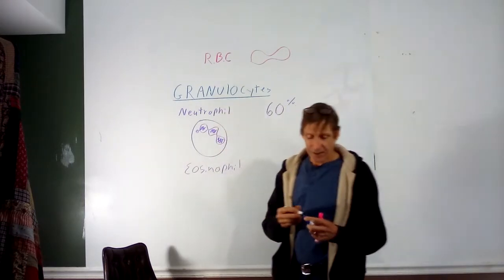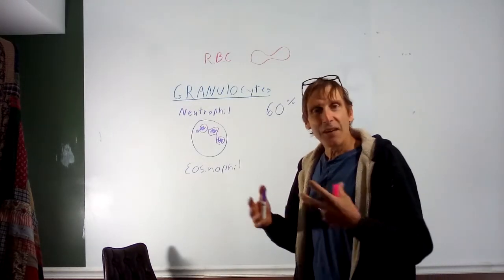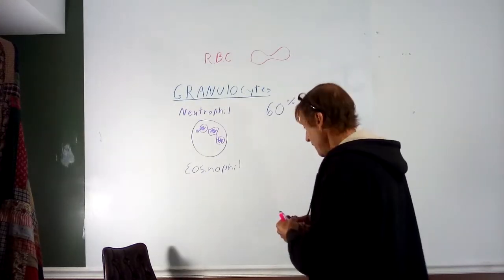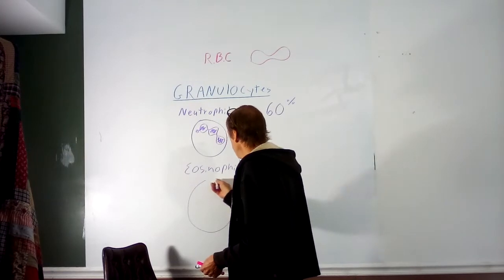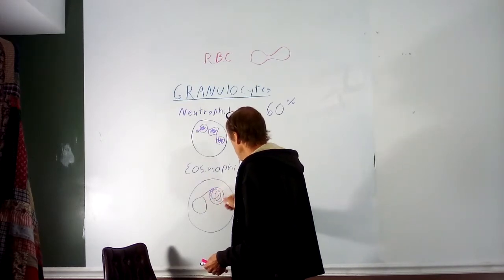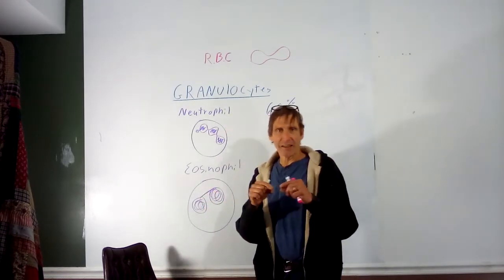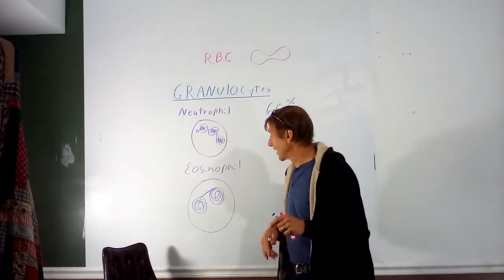An eosinophil. It's named because of its staining characteristic. Eosinophils have granules that have an affinity for a histological stain called eosine. That's where it gets its name from. These are quite distinctive. They will have a bilobe nucleus. So it's kind of 2 big wads there, 2 big lobes, with, you may see, a little isthmus, a little strand connecting them. Bilobe nucleus, not multi-lobe like the neutrophil.